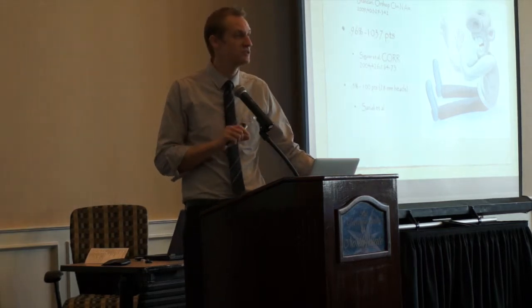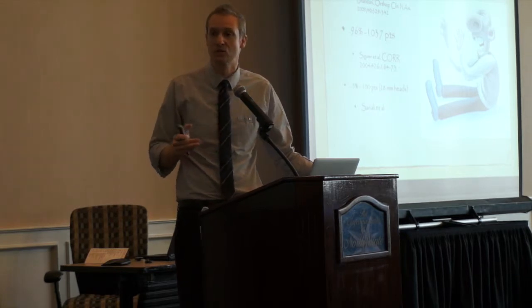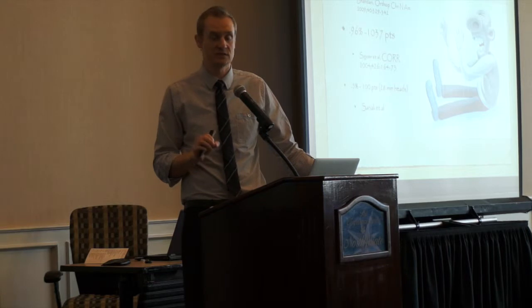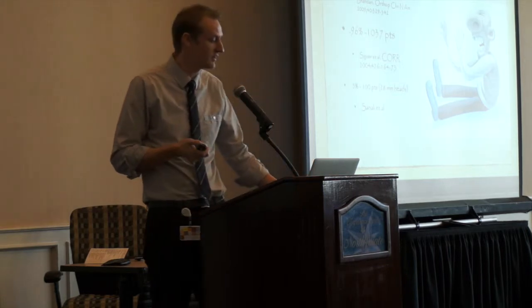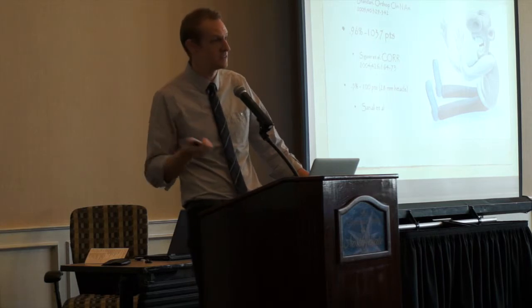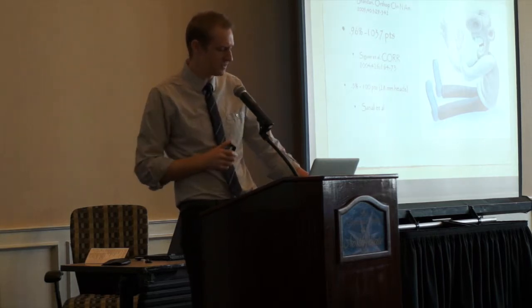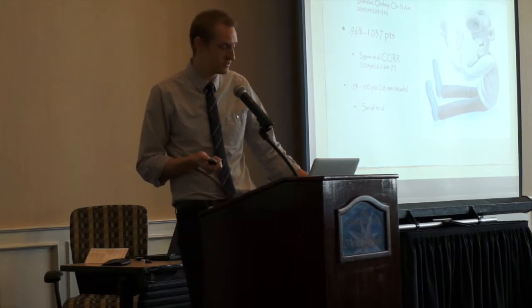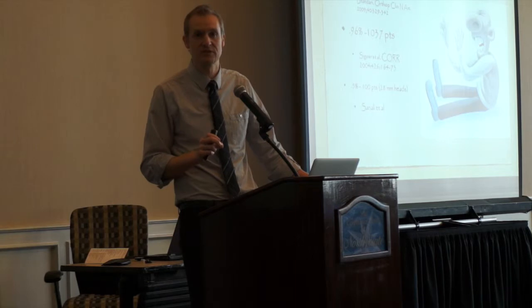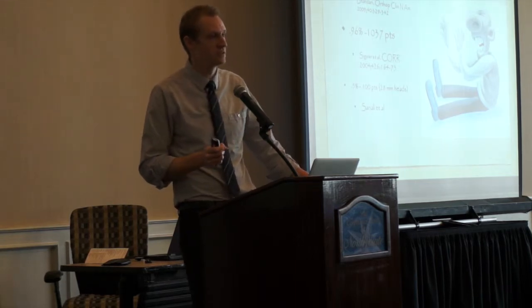Multiple studies using the anterior approach have documented dislocation rates well below 1%. And these are high number of patient studies. So the first one here by Bandari, 1,100 patients, 0.6%. We already talked about Matta's study of 0.6%. Another series of over 1,000 patients, 0.96%. And finally another series had 0.5% dislocation rate when 28 millimeter heads are used.